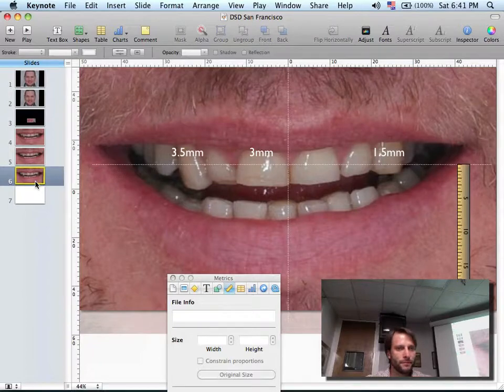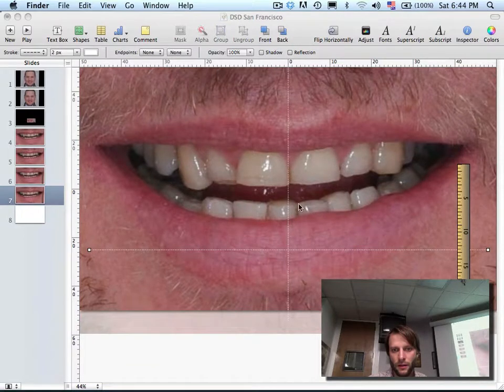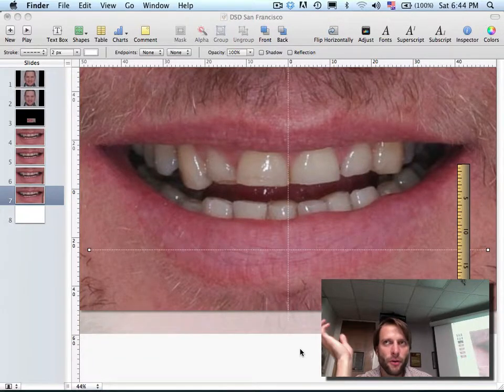Yep. So when you're doing that, you're assuming that you're doing full mouth rehabilitation? When do we want to record that? Now. So now we're going to draw the smile line. Okay, that's the last step before bringing in the intraoral picture.